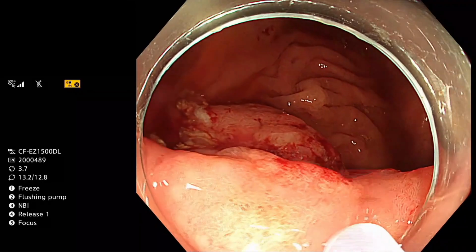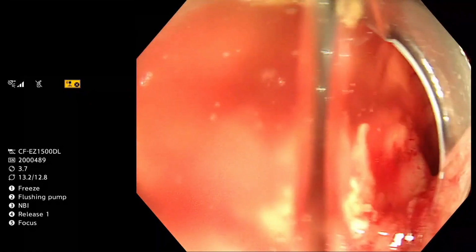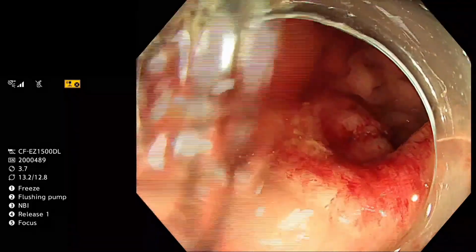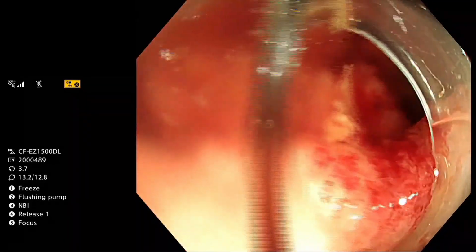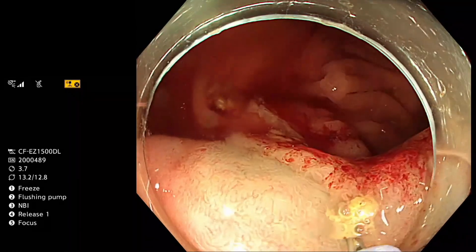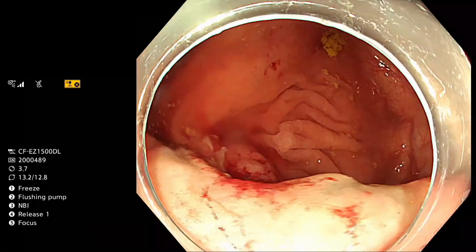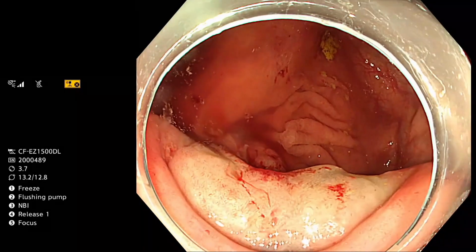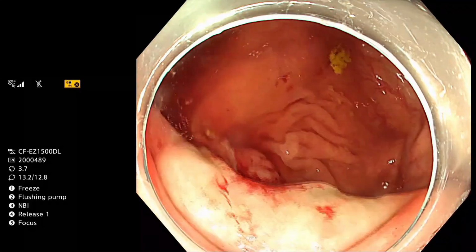Open. So really you've got to inject this margin. Open. Yeah, it's open, sorry. Inject here. And you really got to expand it for our first snare placement. And maybe we're going to use a 15 here, maybe it's too big. We'll find out. But you really need to make an imprint on this margin and make sure it's polyp free.